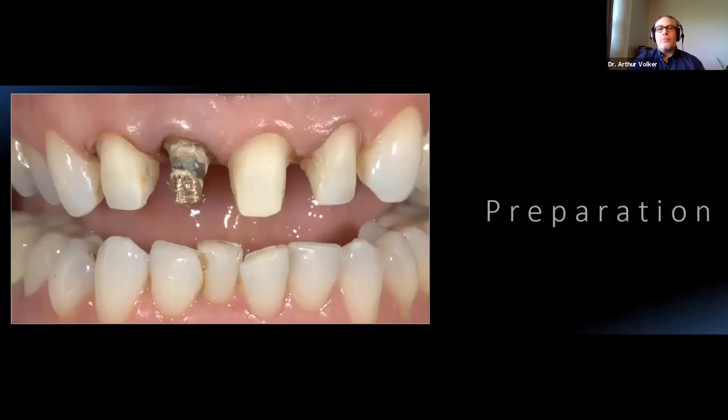When we took off tooth number 8, we had this really, really discolored tooth, again, with a deep margin, which is funny because if you're doing a PFM, you don't have to prep so aggressively. But this is what I found. It's interesting how many times I will take off a dark tooth, and it's almost like the dentist saying, well, I'll give the lab more room. They don't need any more room than a conventional crown because you're going to opaque it with that metal substructure. Anyway, so you can see tooth number 7, we had some caries out.